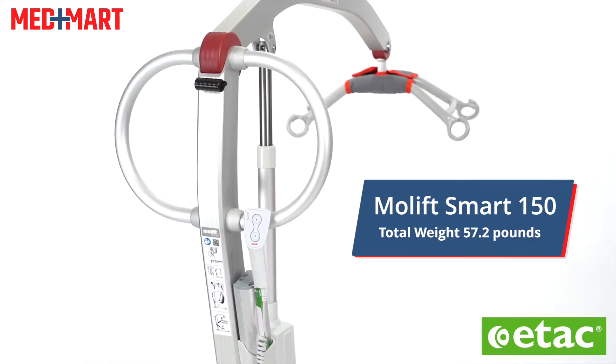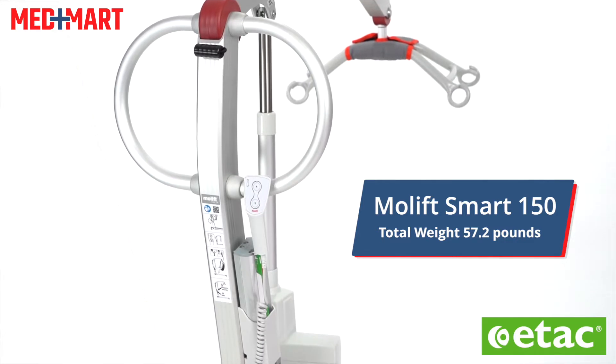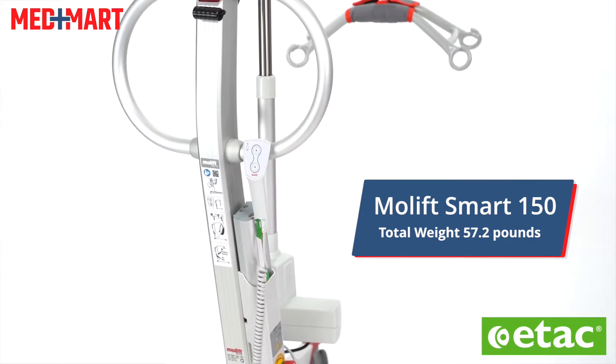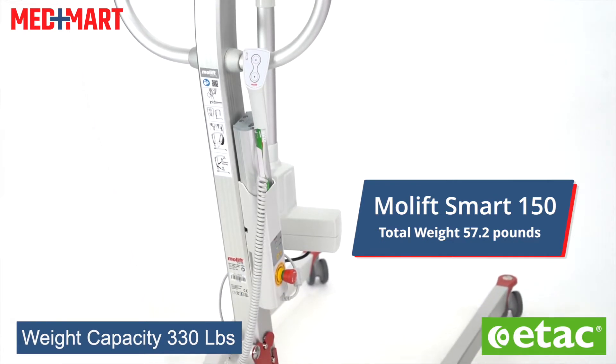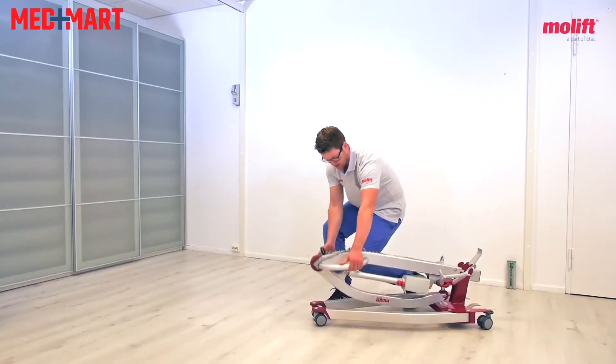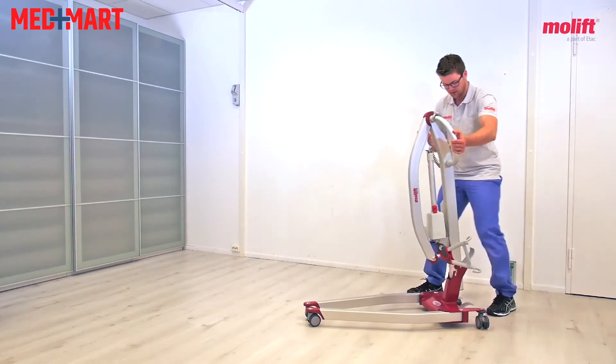It's the lightest lift on the market that I've seen here at MedMart. It is under 58 pounds, made of aluminum and steel, and has a weight capacity of 330 pounds. This is easily foldable and easily breaks into two pieces.